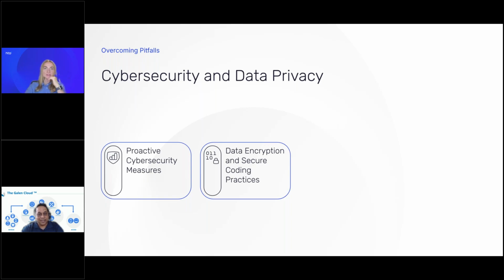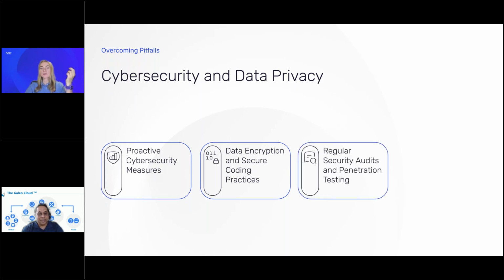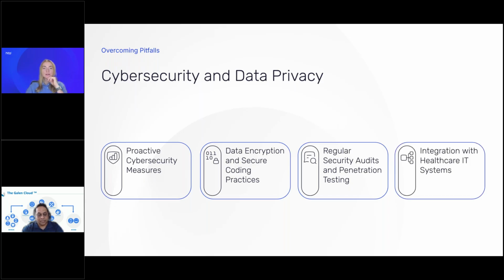Exactly. So what you mentioned, secure coding practices, right? Very important. And then I would say that also regular security audits and pen testing are very important. You've got to check and actually try to hack your application before the hackers do. So it's also important to do audits to check. And then integration with healthcare IT systems, because breaches very often happen during the integration. So it's very important to do it in the right way, with the right partners, with somebody that really understands that and knows how to do it.